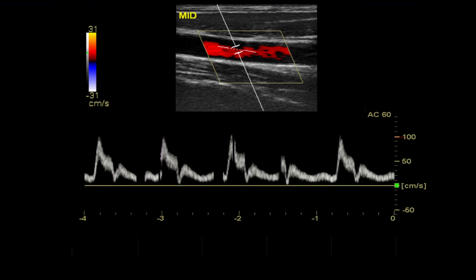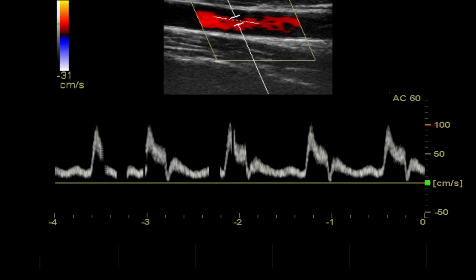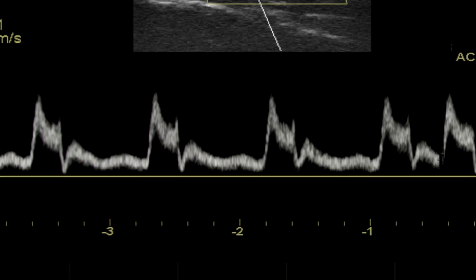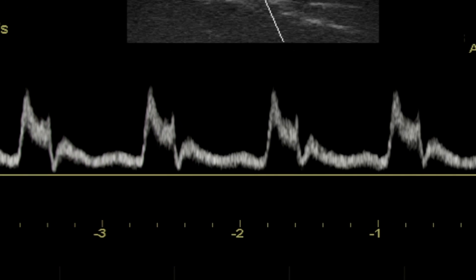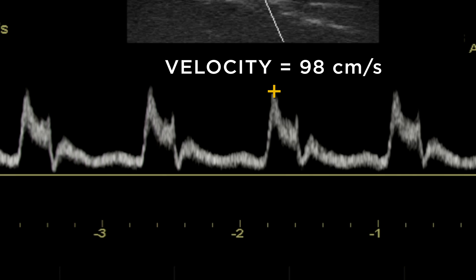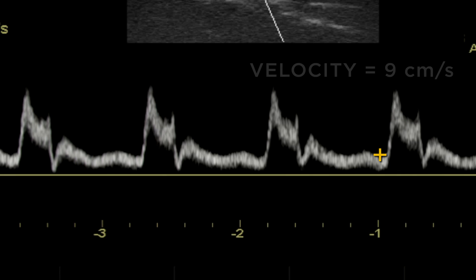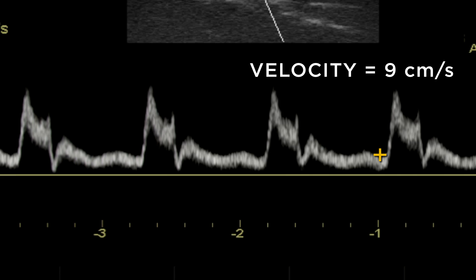Obtain a numeric value for flow velocity by using the measurement tools. Freeze the image and place a measurement caliper at the point of peak systolic velocity in the waveform. The end diastolic velocity can be measured by placing the caliper at the lowest point of the trough just before the systolic waveform.